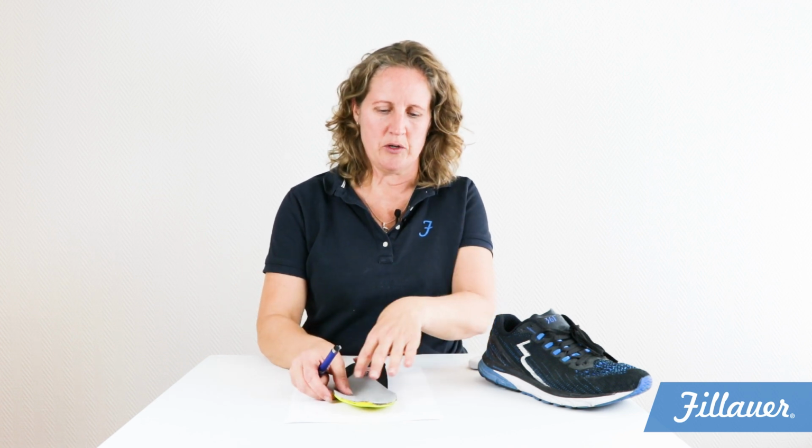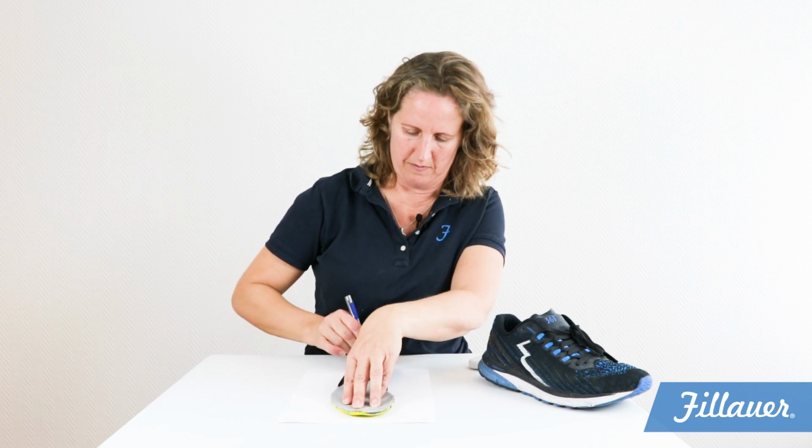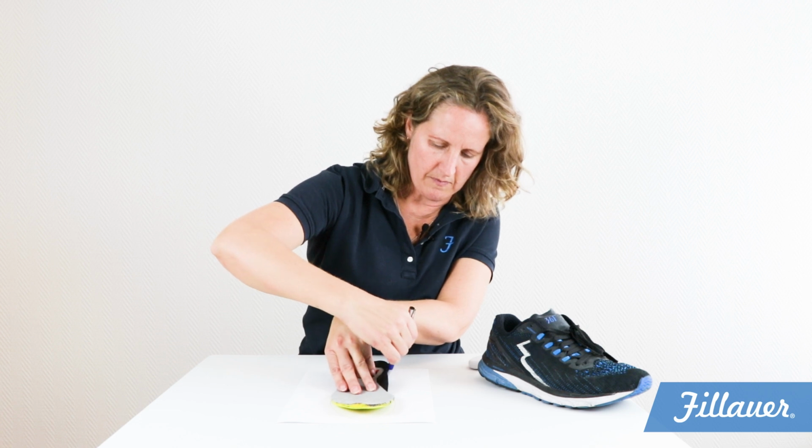The cast is used to make the brace fit the patient. We only ask for a minimum of measurements and you need to give us all of them. If you want to improve the fit of the foot plate even further, you can send us a trace of the insole. You take a piece of paper, place the insole on it and trace it, and you send this to us.